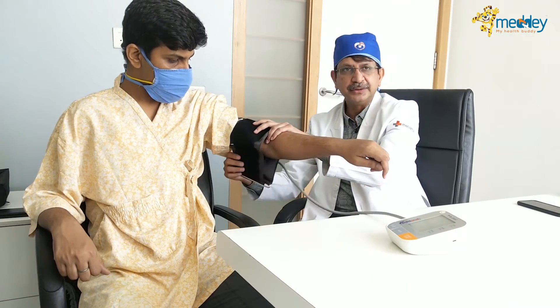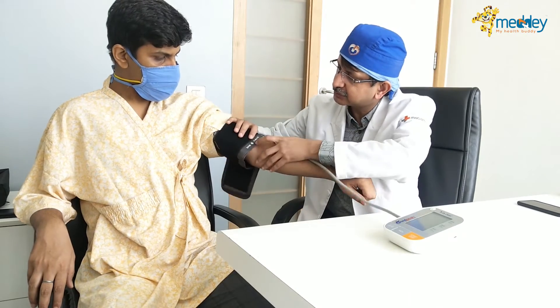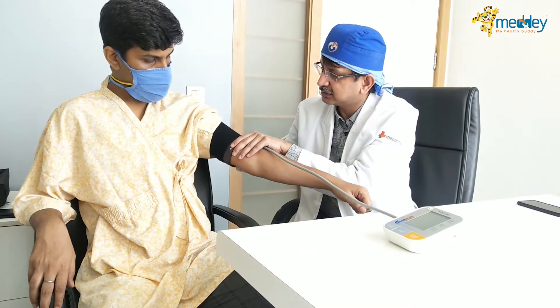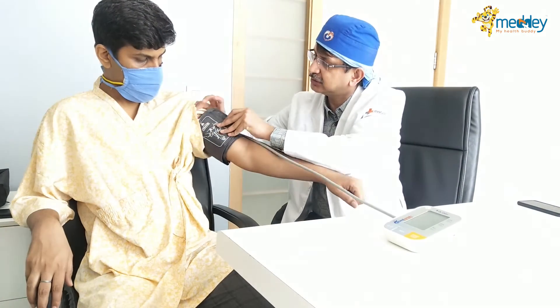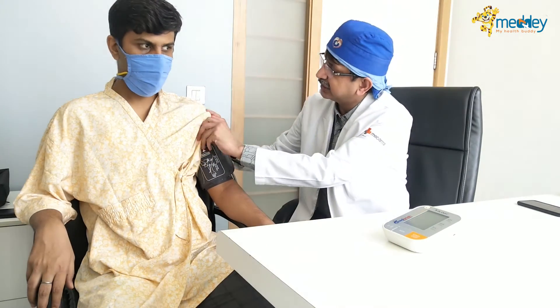For blood pressure measurement, you have to use the right size of cuff and measure blood pressure on both limbs, using whichever gives a higher reading. When tying the cuff, find the artery mark — this should be in the middle of the arm with at least one inch gap above the elbow, so the elbow can move freely. Clothes should not be too tight around the arm.